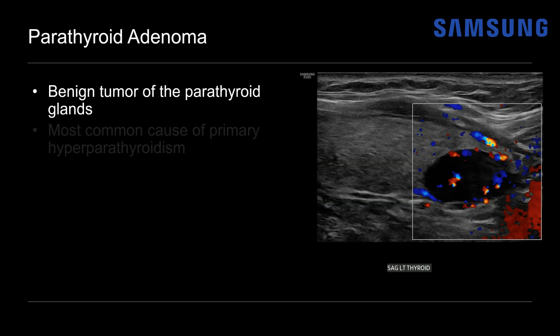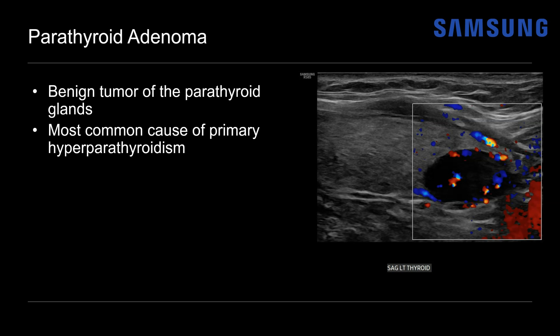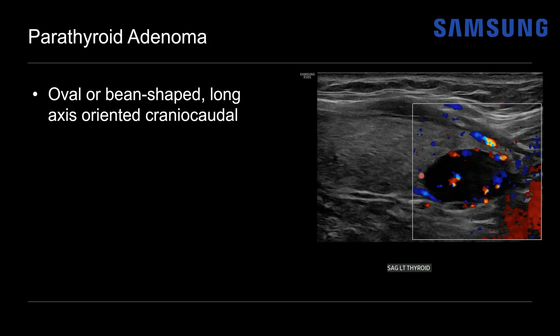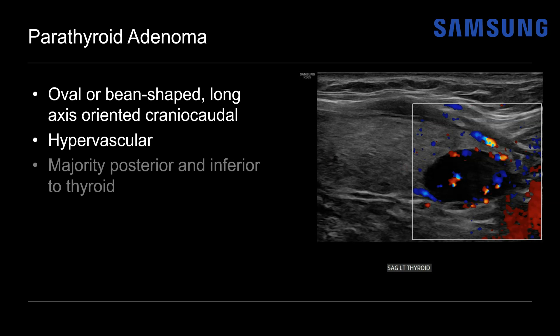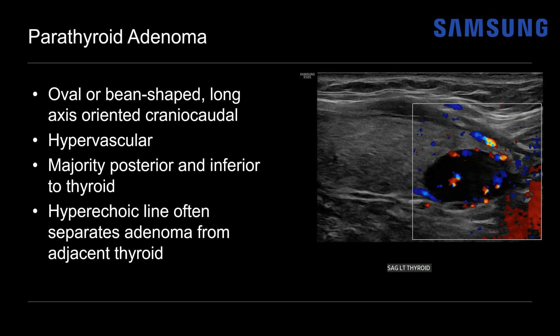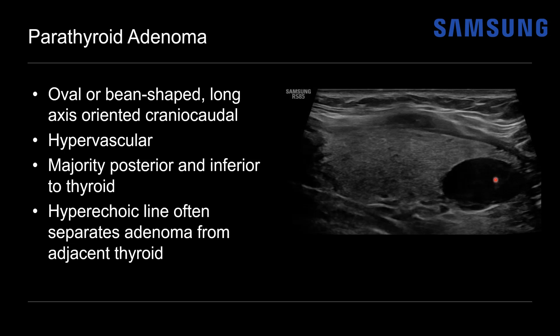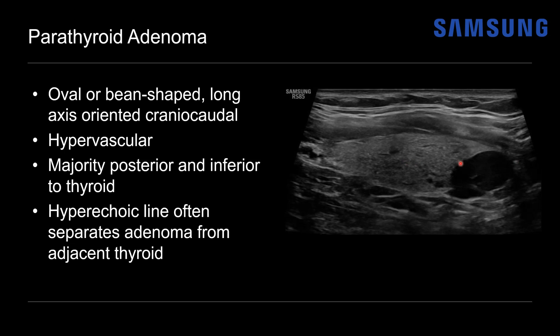This finding is typical for parathyroid adenoma — a benign tumor of the parathyroid glands and the most common cause of primary hyperparathyroidism. Patients usually present with elevated serum calcium and parathyroid hormone levels. On ultrasound, these adenomas will usually be solid, homogeneous, and very hypoechoic, as in this case. Sometimes they can have atypical features such as cystic degeneration and rarely calcification. They're usually ovoid or bean-shaped with their long axis oriented cranial-caudal, and they're often hypervascular. Most will be posterior and inferior to the thyroid gland. They can mimic a nodule, but a hyperechoic line separating the adenoma from the adjacent thyroid may be seen, and this is sometimes better appreciated on real-time imaging — here we can see that thin hyperechoic line and this ovoid, very hypoechoic, solid nodule oriented in long axis with the thyroid gland.